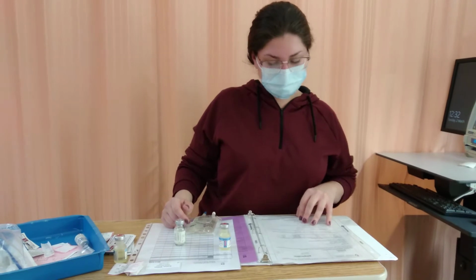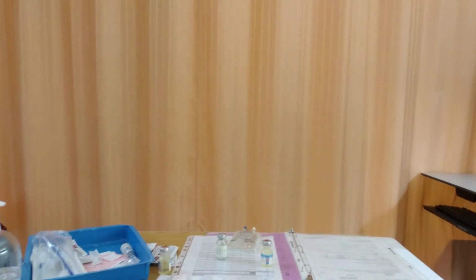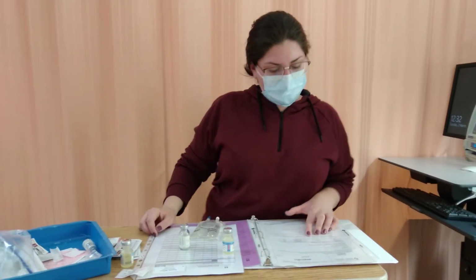So I'll first lower the primary bag. How much time is left? My primary bag, I can okay. So yeah, we're just going to choose the 50 milliliters with the 1 gram dose.